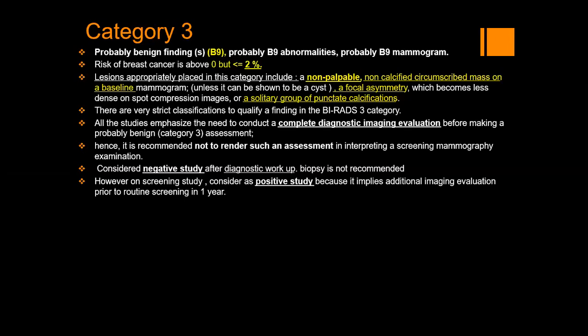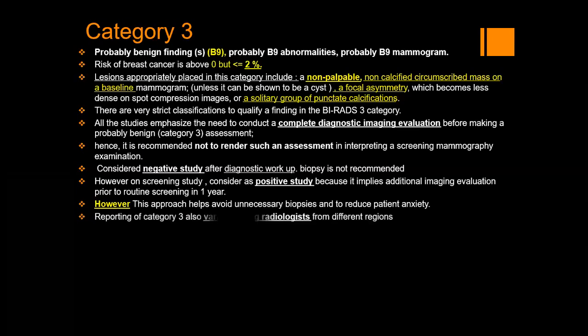Because another study has to be performed before the next screening. However, this approach helps avoid unnecessary biopsy and reduces patient anxiety, and the reporting of category 3 varies among radiologists from different regions.